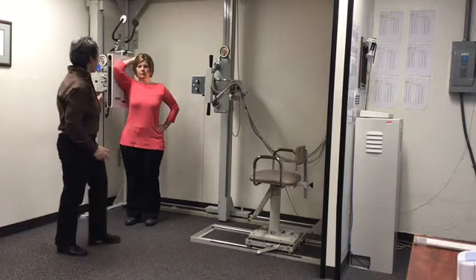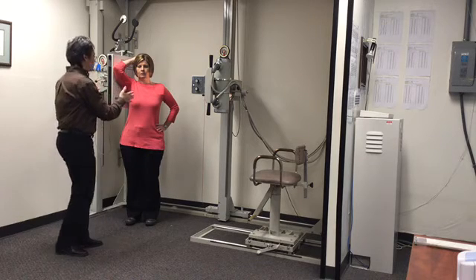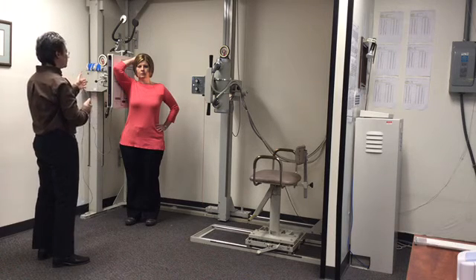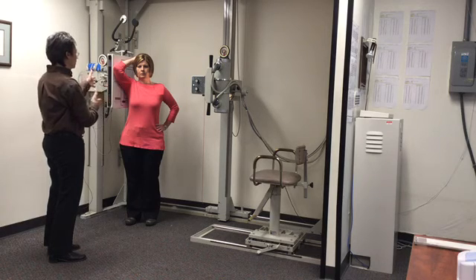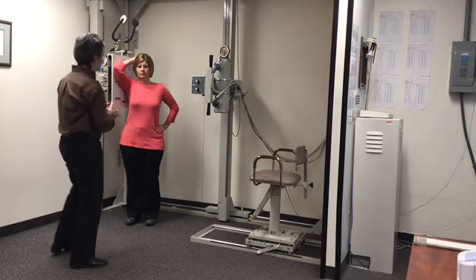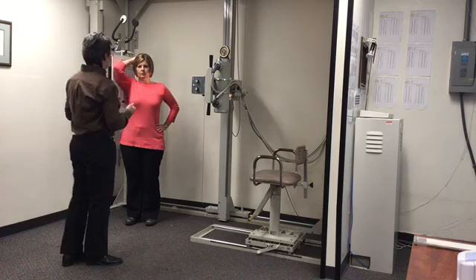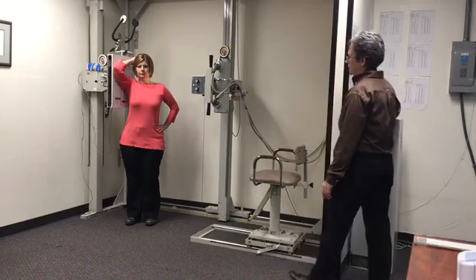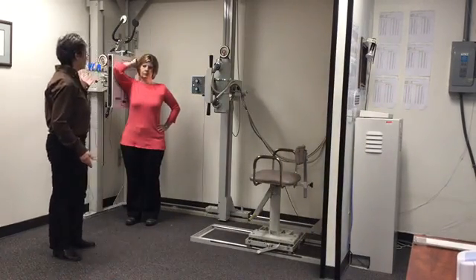Okay. The other thing that they may ask is what is the rotation position of the patient's body in relation to the bucky on this image. And I know that the patient physically looks like she's about 45 degrees rotated in relation to the bucky, but the answer is that the patient's spine is at a 10 degree rotation in relation to the bucky. Okay, so those are two things that you need to understand. The rest of the imaging is the same, so the patient would take a breath and let it all the way out, hold it out, and we would make the exposure. The ending of the steps would be the same as that of the Marchiori.